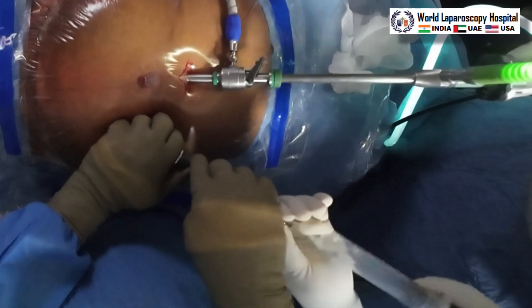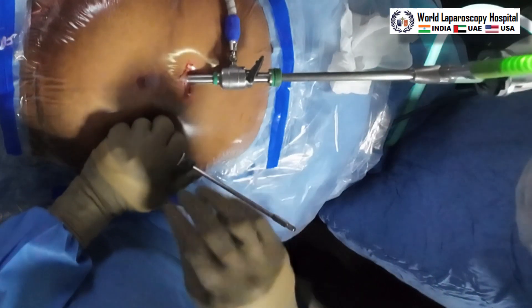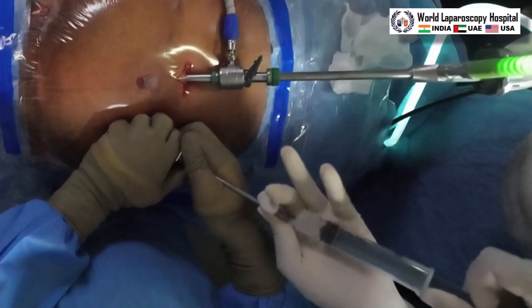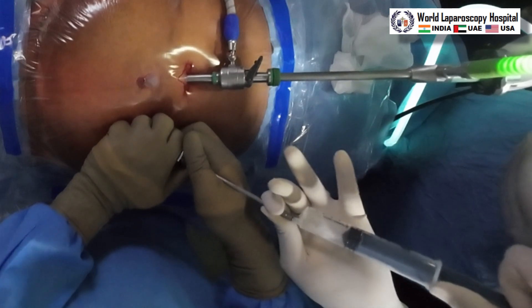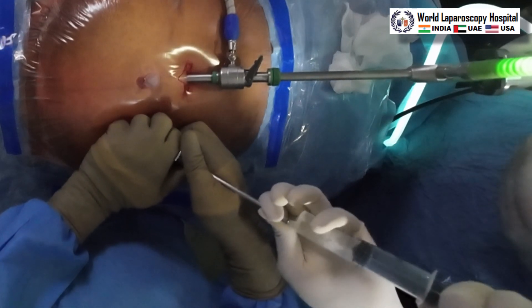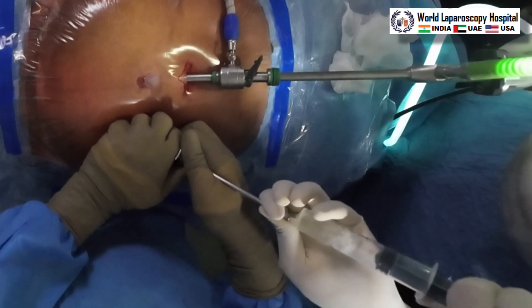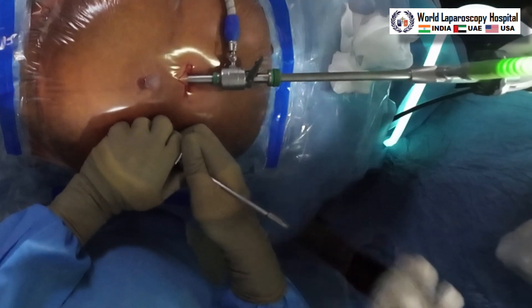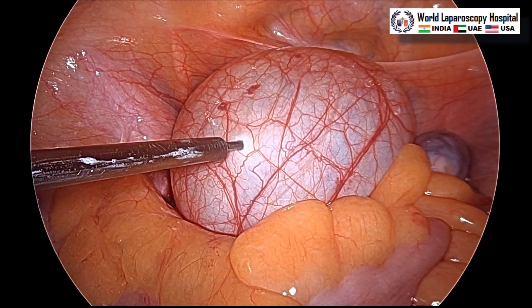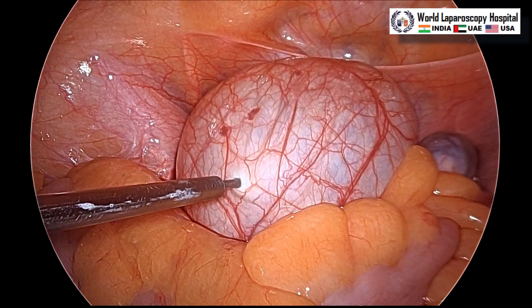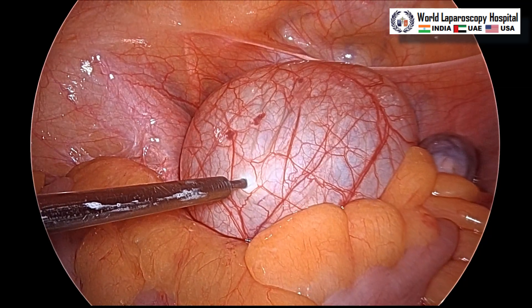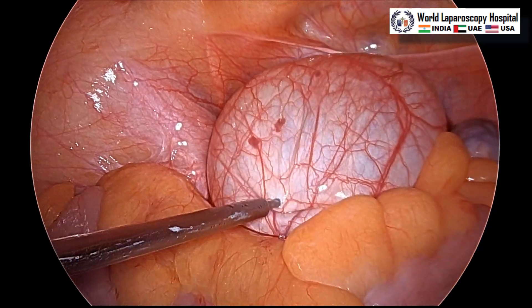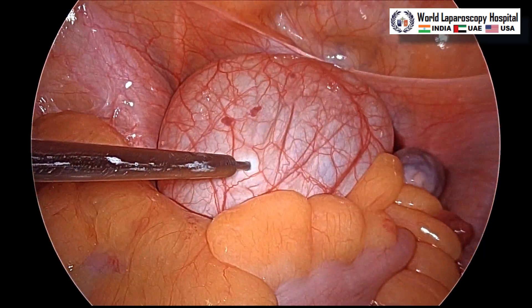There is no endometrioma, there is no dermoid. It is a colorless, simple serous fluid, and that will be sucked. Sucking has the advantage that the cyst will collapse. After that you can hold it with the grasper. Up to a four centimeter cyst you can try to separate it without puncturing, but beyond that it will slip from the grasper and you cannot remove it without aspirating first.